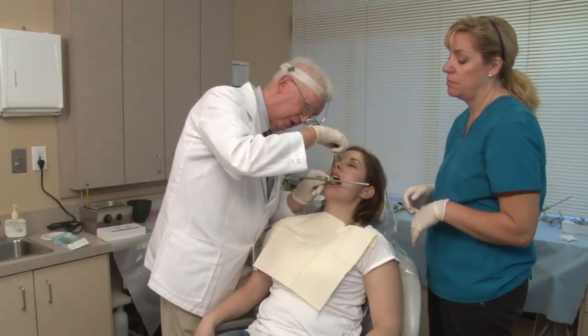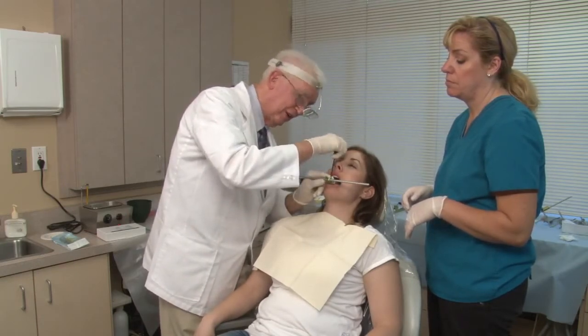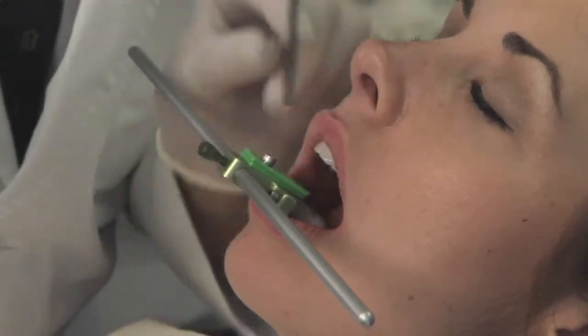When you do this procedure, be very careful. Control that screw. Don't drop it, so it doesn't go into the patient's mouth.